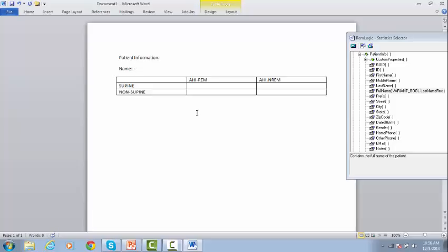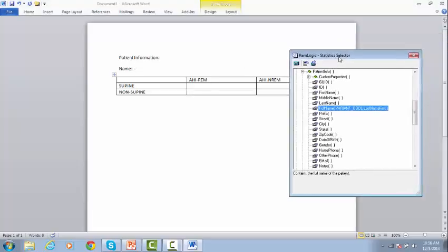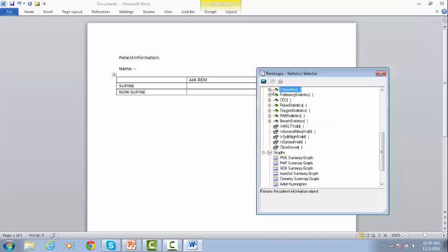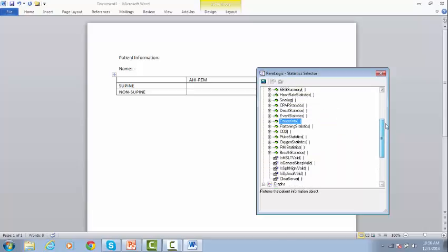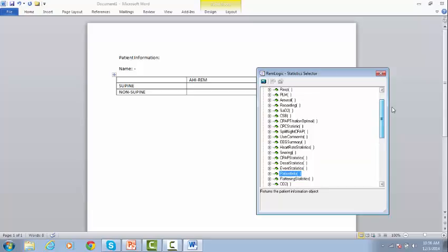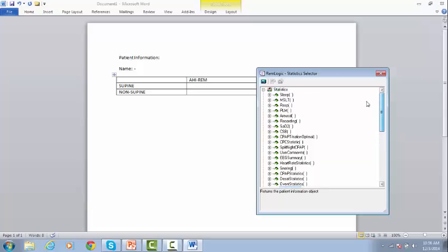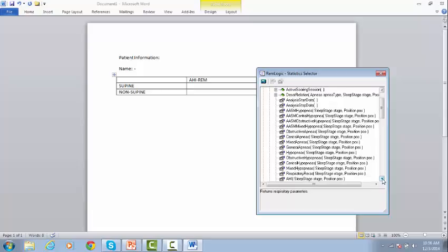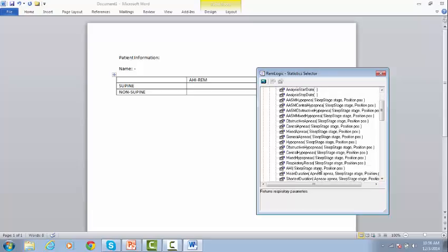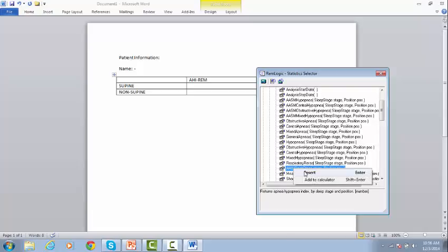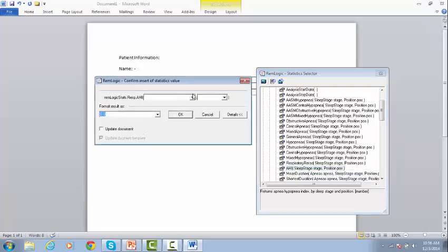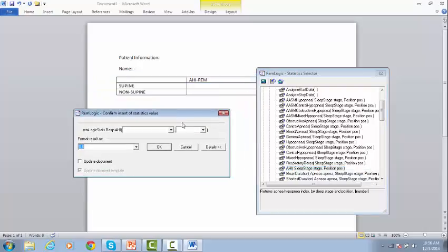Place the cursor in the correct position, and go to the Statistic Selector menu, and search for Respiratory. Under the Respiratory, go to the AHI, right-click on it, and click Insert.